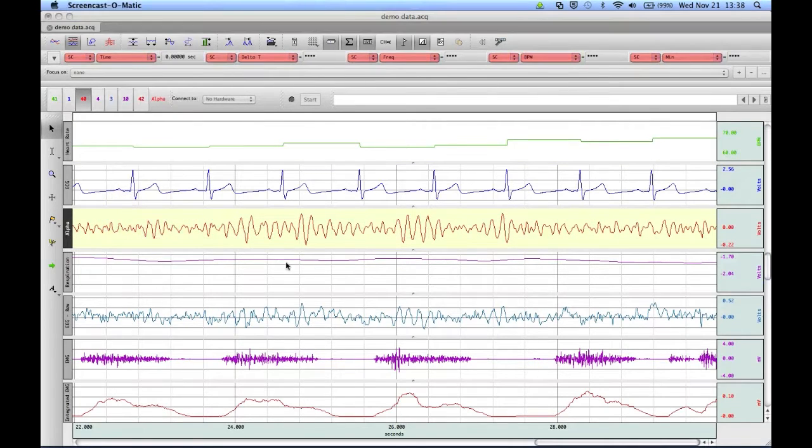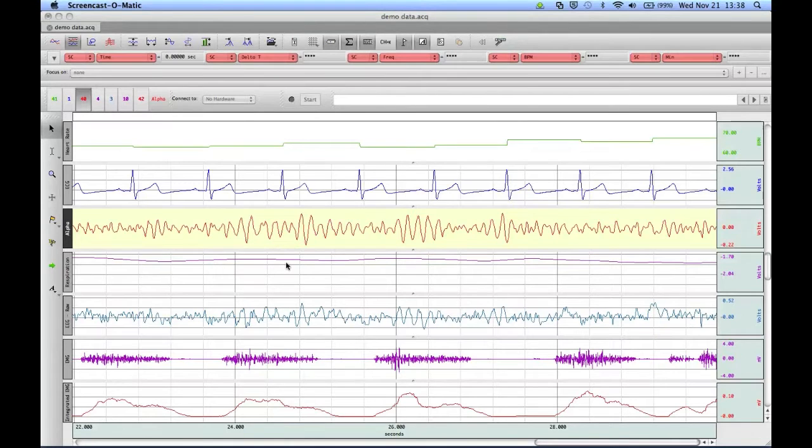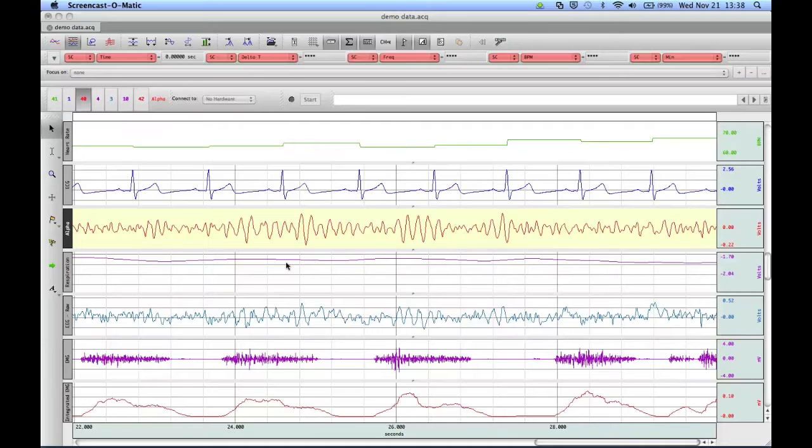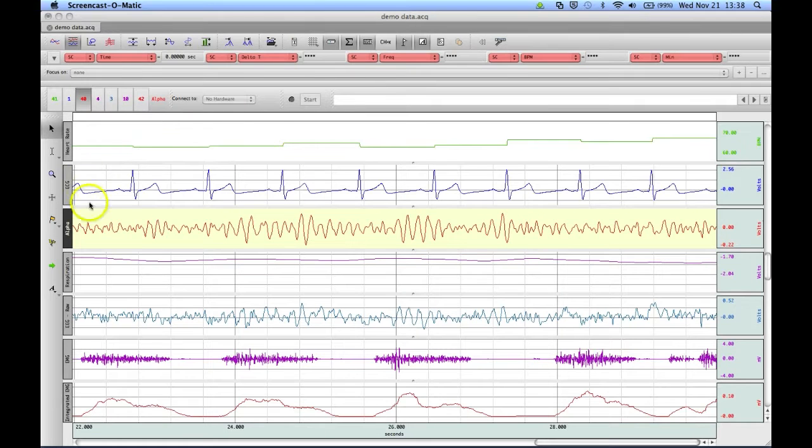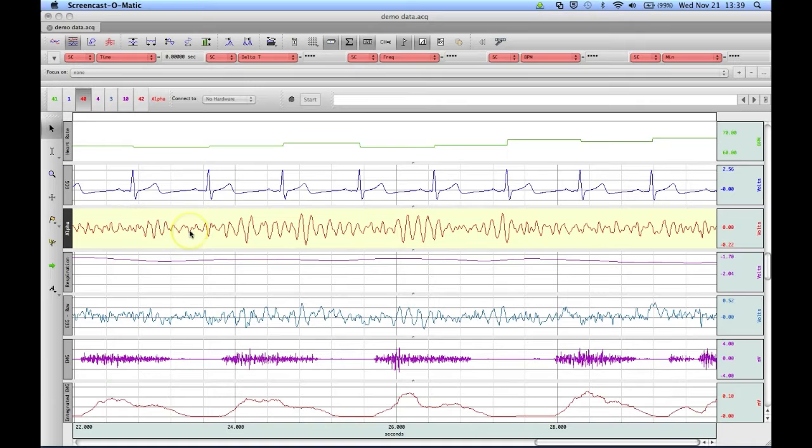When you have grids enabled on your display, there are a variety of ways that you can customize how they appear. The newer feature in AcKnowledge is customizing grids per channel of data. What this means is that we can have a different grid setting for our ECG waveform than we do for our Alpha EEG waveform.